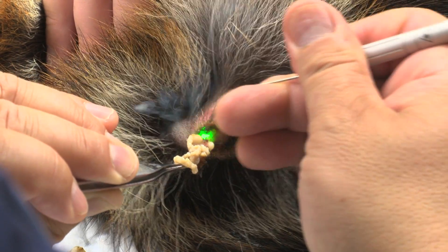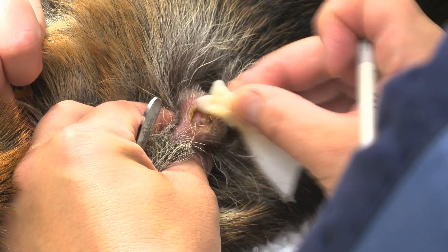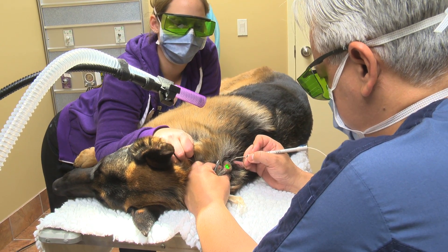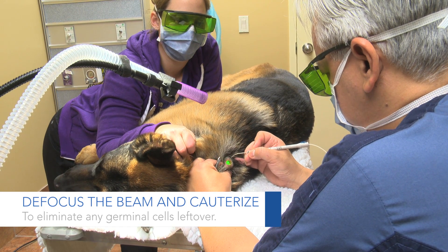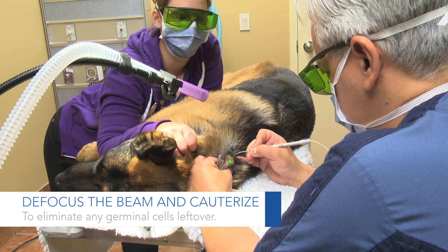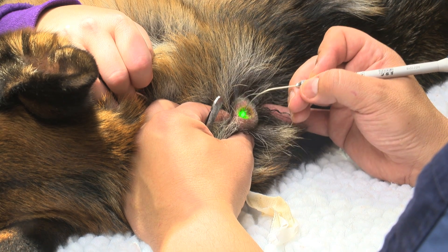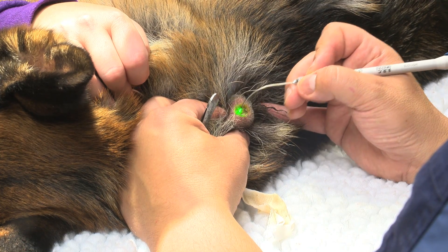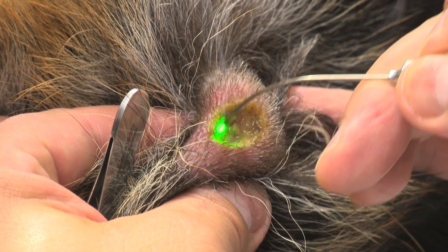So we're almost through here — just a few more. There we go. I like to laser ablate the base of any mass that I take out. It's simply a matter of feeling comfortable that I haven't left any germinal cells in there. So I'll do a nice pass over with the laser — I like to do kind of a crosshatch — hopefully making sure that I've captured all the base area.